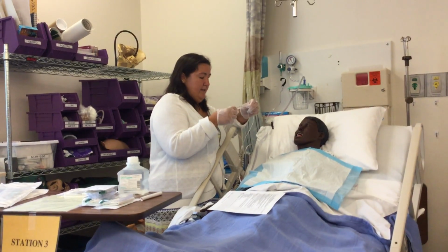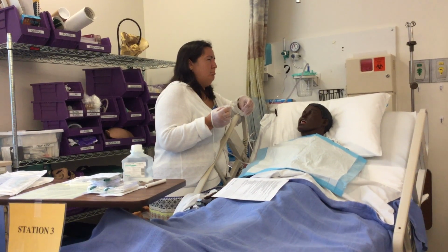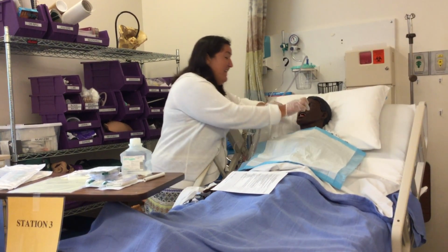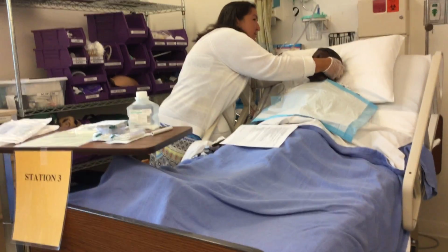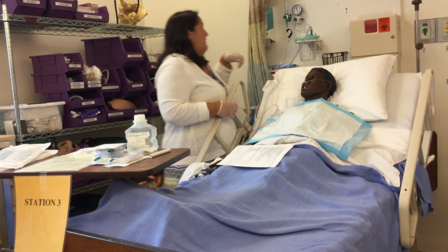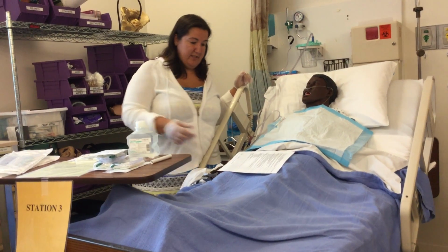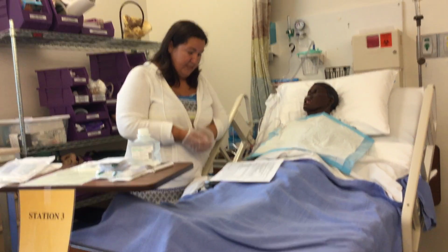Do you want us to clean the cannula first then, before? Clean it? Yeah, like with... It's clean. They've been wearing it. The patient's going to have oxygen. So what I want you to do is turn it up a liter or two from where it's at. So you're hyperoxygenating. Let's say they're on a liter, I'm going to turn it up to 2 liters. So I'm hyperoxygenating my patient. So my patient's being hyperoxygenated.